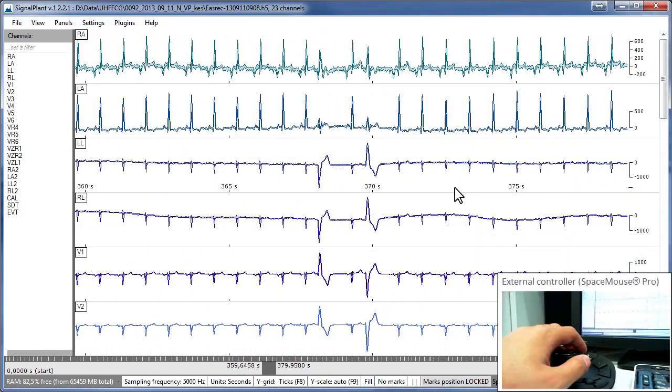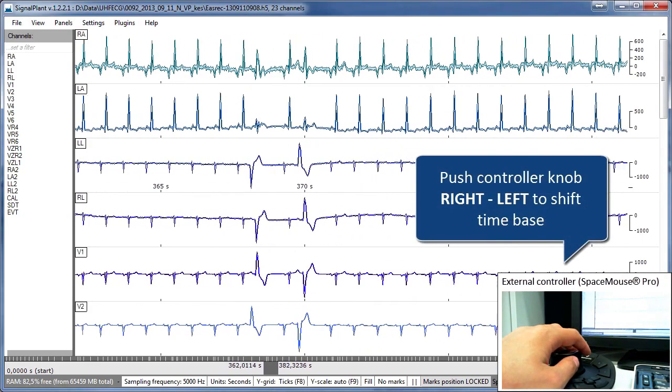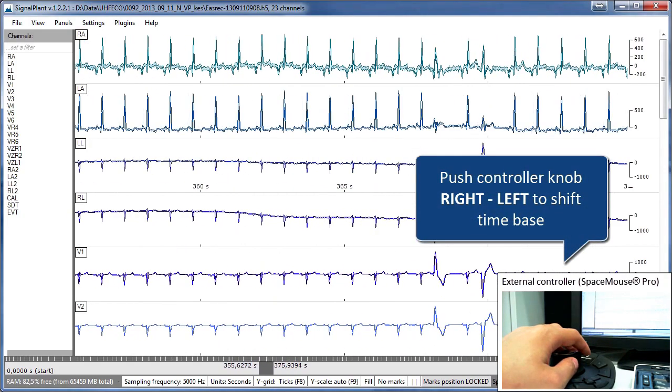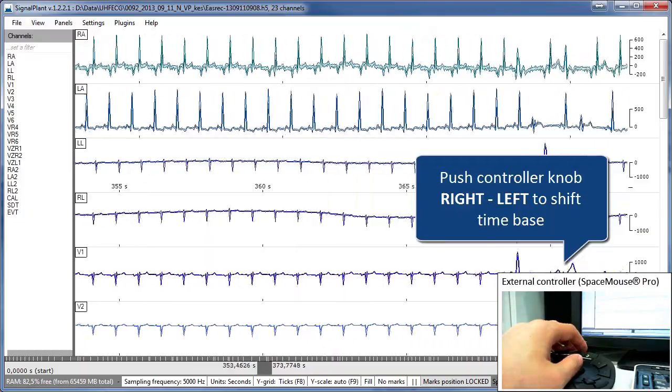You can change time base by pushing controller knob left or right. Scrolling speed is proportional to applied force.